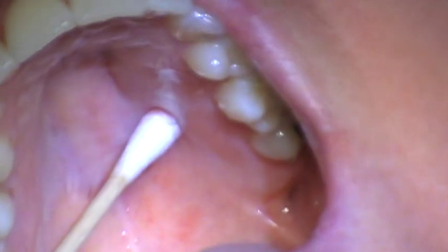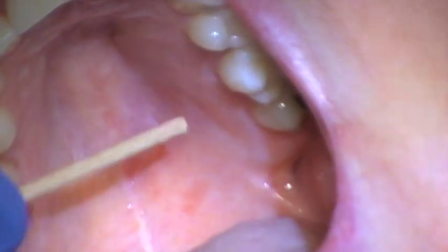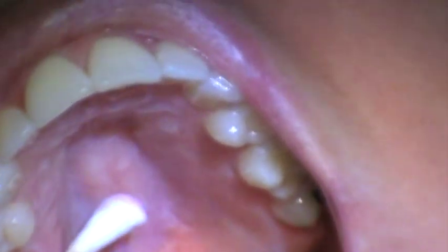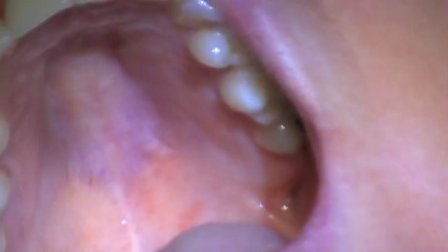You don't want to be back into the soft palate — you can see the line for her soft palate right here. Her foramen is actually pretty close. You can kind of see a purplish look right here over the foramen. So now I've got my site.